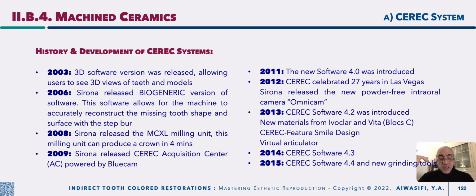Finally, in 14, CEREC software was upgraded into 4.3, and in 15 into 4.4, okay, with new grinding tools that could reproduce the fine details of your fitting surface and the fine details of your anatomical tooth form and shape.